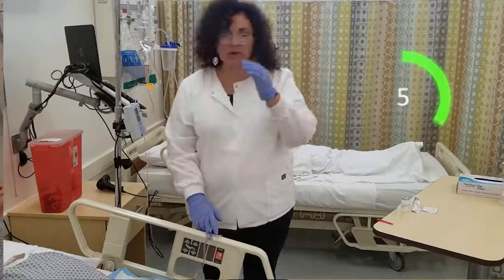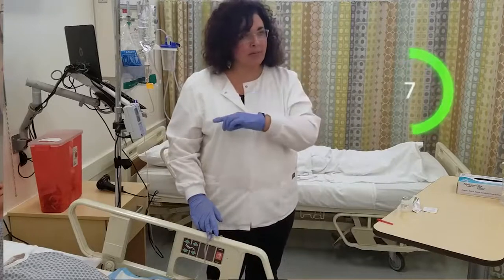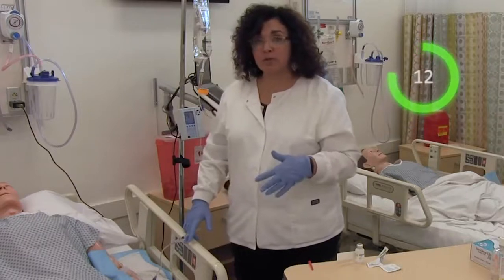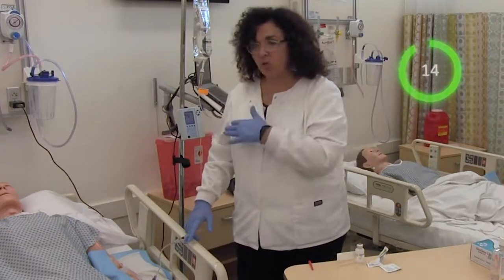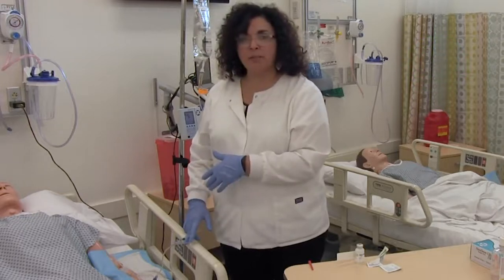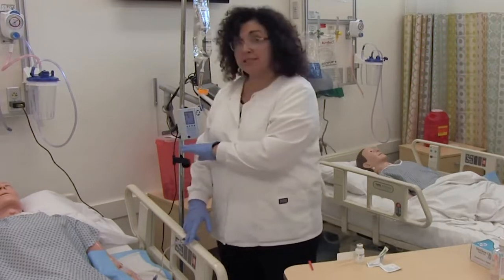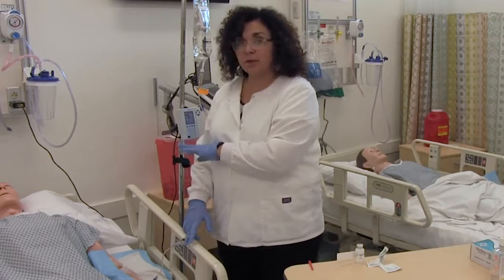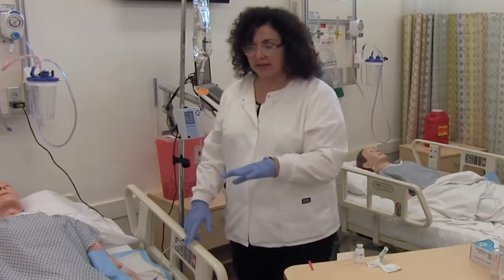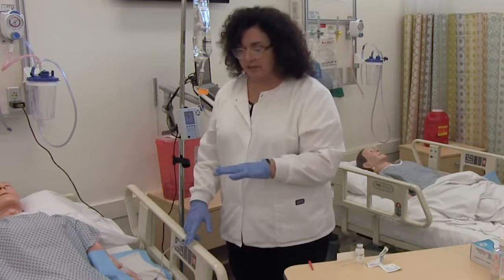Now the pump, you'll hear, is alarming, and that's simply because I'm pinching the tubing and it's picking up a downstream occlusion. So just don't worry about that. And when you release the pinch, it'll stop alarming. And if the pump should turn itself off, make sure that you turn it back on, because again, we need the flow to bring the medication into the bloodstream.